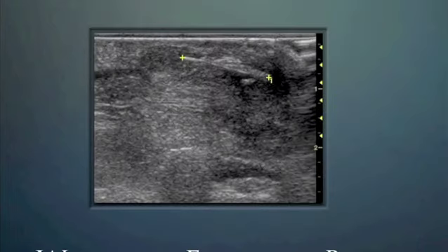Another example of a wood foreign body, very hyperechoic, and just measuring its length and its two axes here. The next step would certainly be to inject lidocaine all around this foreign body, so it's easier to take out and so it's easier to see.